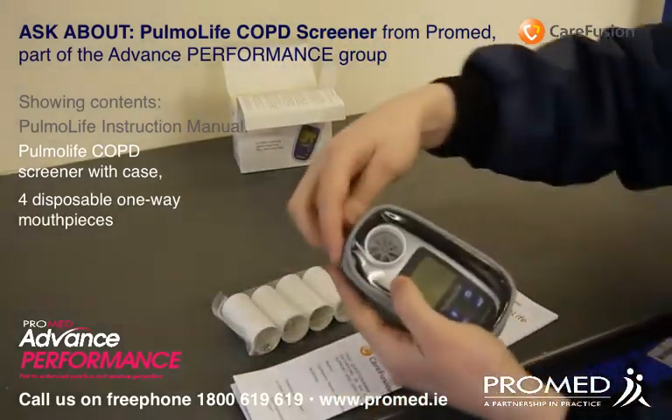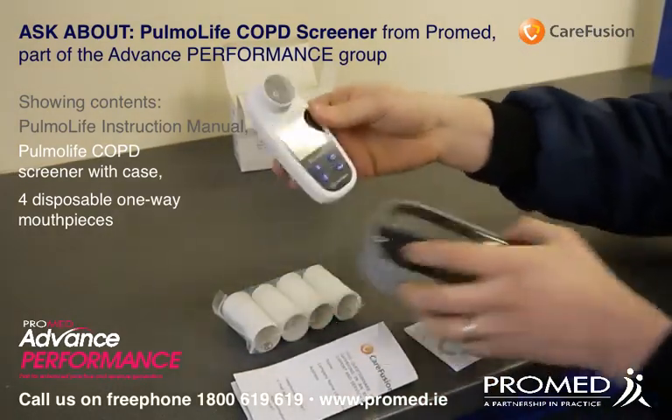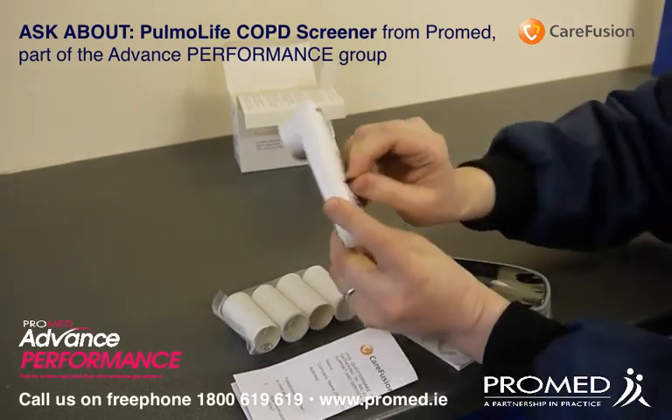I'm now going to take the product out. You can see on the back of this unit there's a tab to make the battery contacts.